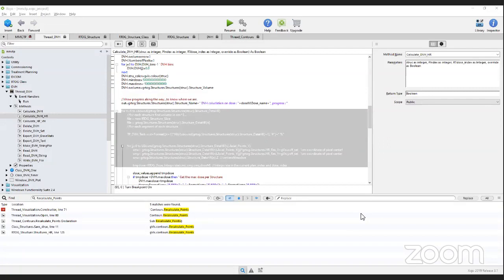discrepancies. It's not to say that one is better than the other, but when you do see discrepancies, it should be an indication that maybe it needs to be investigated further to figure out why the volumes aren't closer.